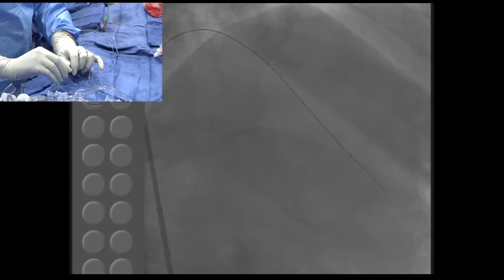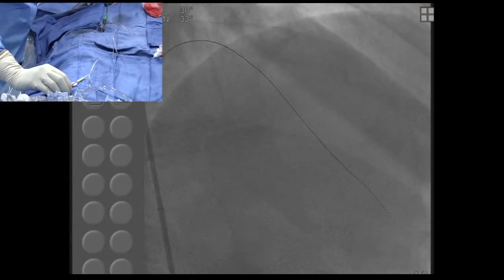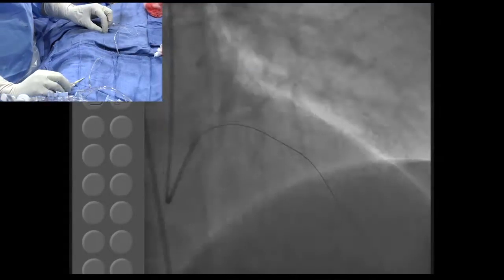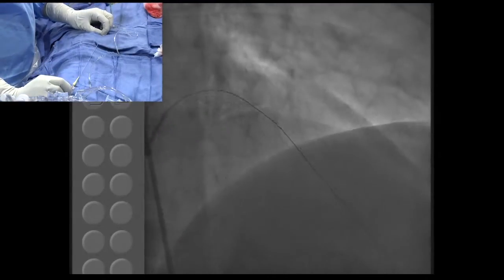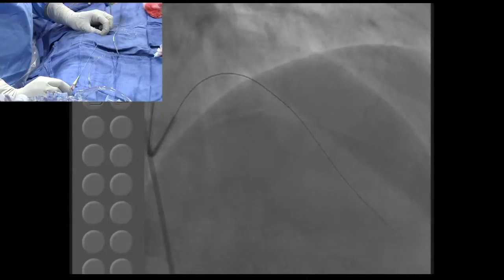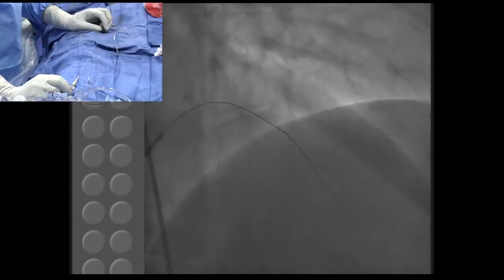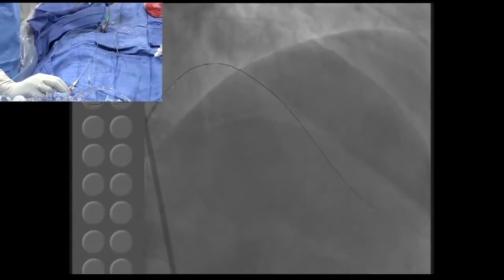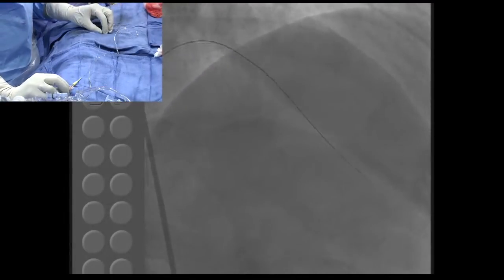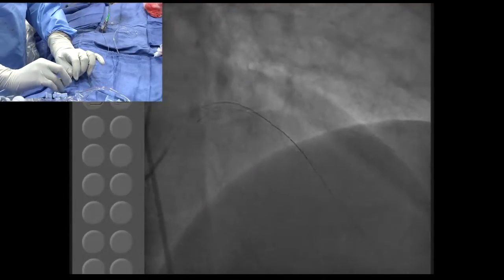And rotate. Actually, I have seen even with Fine Cross, just like Corsair, you can rotate. Sir, can you take a deep breath? Take a nice deep breath. Another deep breath. You can't be too aggressive in that situation. The guide will come out and everything will fly out. So just try as much as you can. If not, we change our strategy here.